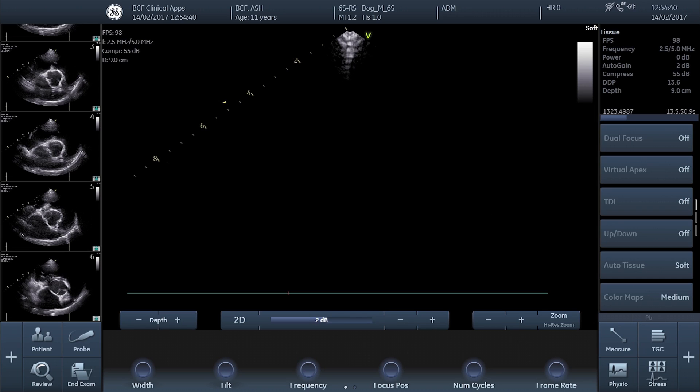There are other methods that can be used, but a debate about their relative merits is outside the remit of this video. The measurements required for calculating the ejection fraction using the modified Simpson's method are made on a right parasternal long axis 4-chamber view, and their accuracy is enormously dependent upon acquisition of good quality views optimized for the left ventricle.